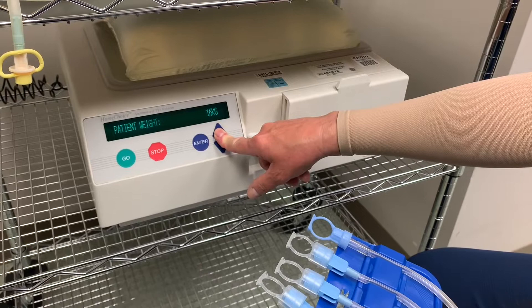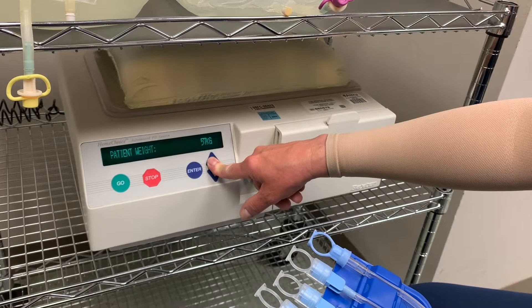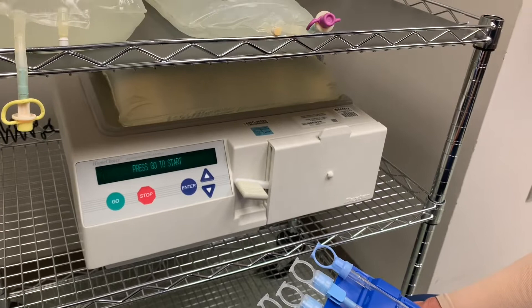After shutting off and restarting the machine, you have to enter a weight above 70 kilograms — this is only for adults; we do not use this for pediatrics in this hospital. Enter 70 or above, confirm it, press Enter, then press Stop again. It goes back to the cycles and dwell time. Now it says press Go again to start.